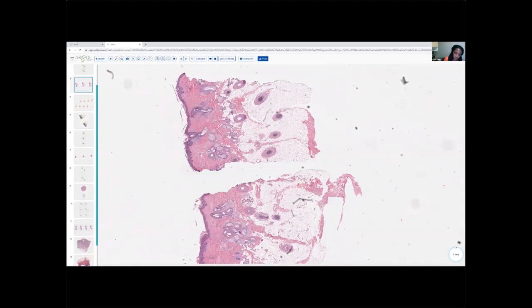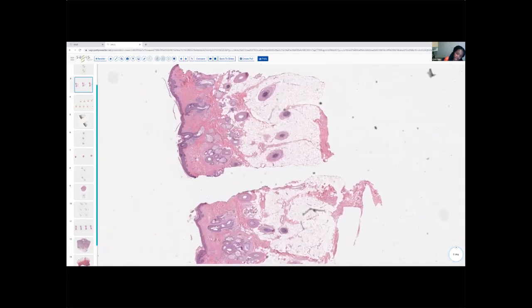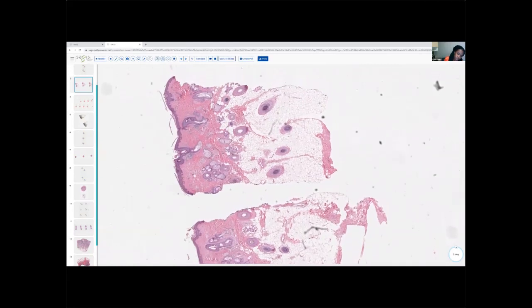And we want to understand why that's happened. So let's look around and understand what other features are present here in contrast to our last case. So we have this miniaturization, that's what I've just described, where we have more hairs where the base or bulb is situated in the dermis rather than in the subcute, and it is profound, it's striking.